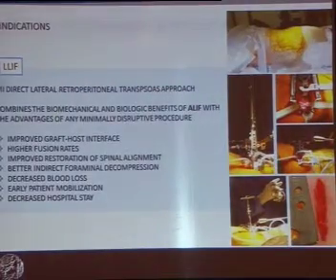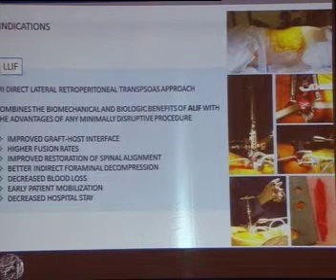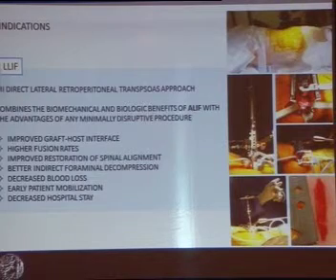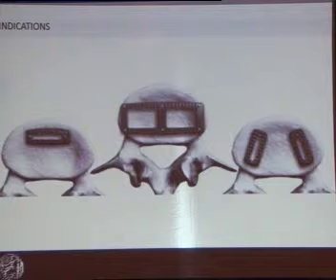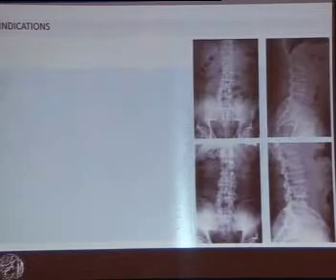better foraminal decompression by achieving greater correction of the intervertebral and foraminal height, decreased blood loss, early patient mobilization, and decreased hospital stay. The major advantage of LLIF over previous methods is the insertion of wider implants that span the dense ring apophysis and provide excellent mechanical support to resist subsidence and maintain the disc height.